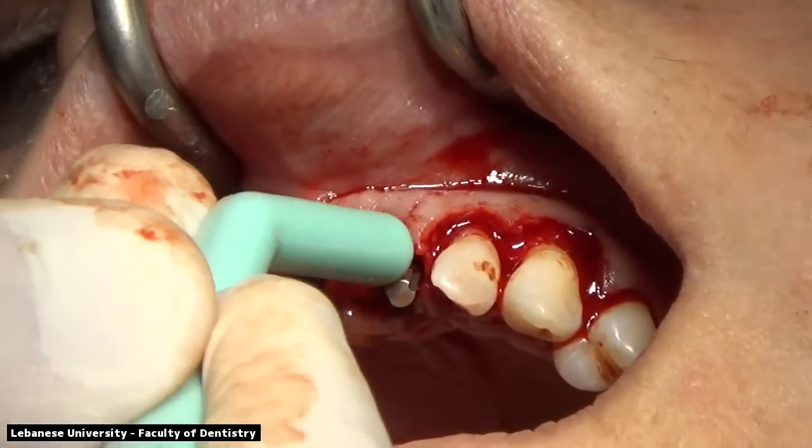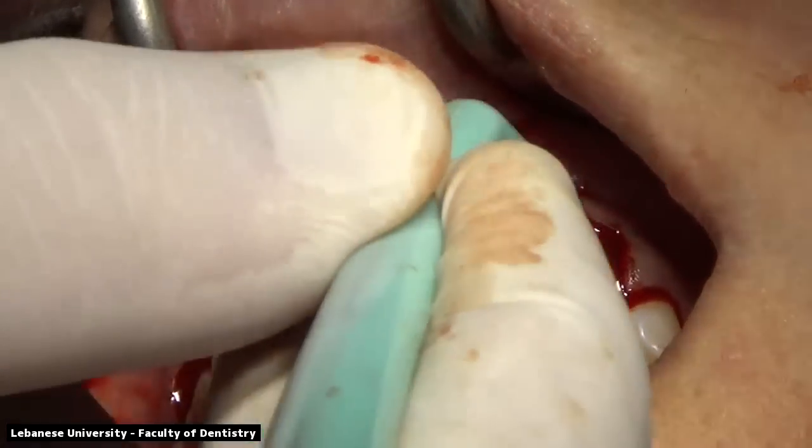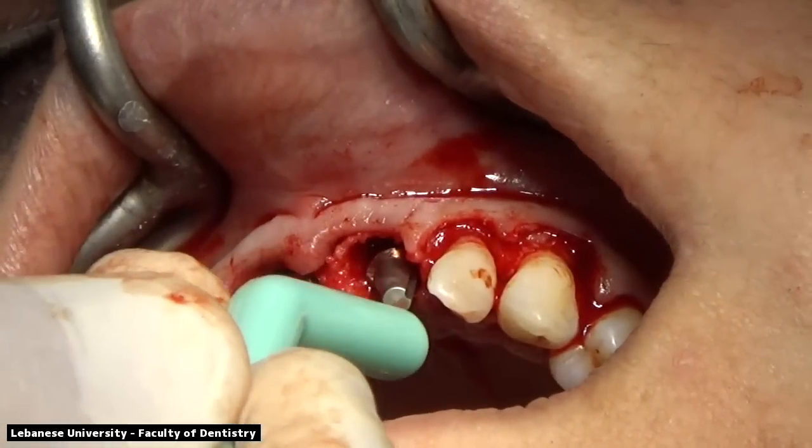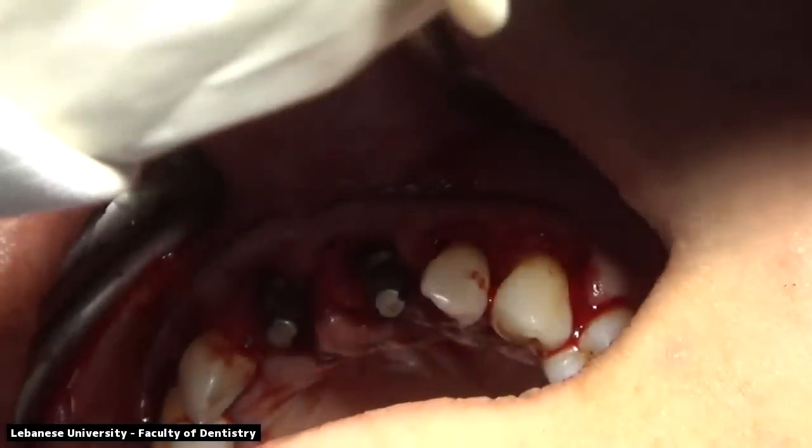We're preparing our resin acrylic material so that we can add it to the inner surface of the 2 temporary restorations that have been prepared previously, so that we can do the relining to the margin of the abutment teeth that are placed.